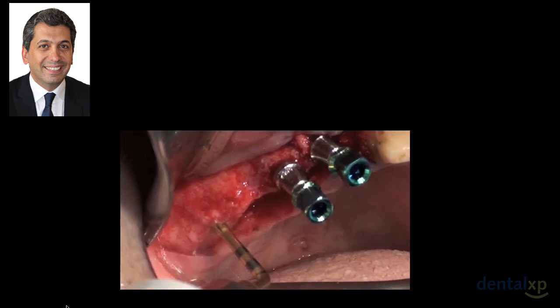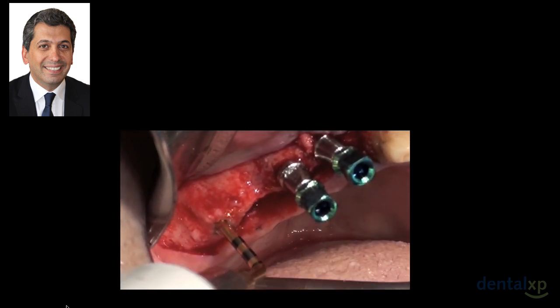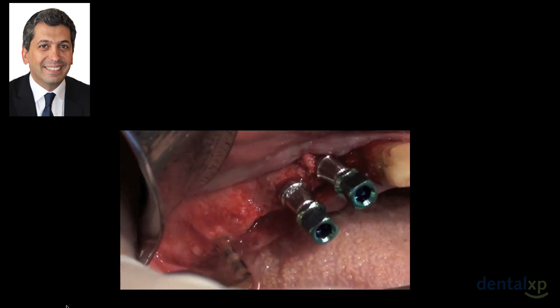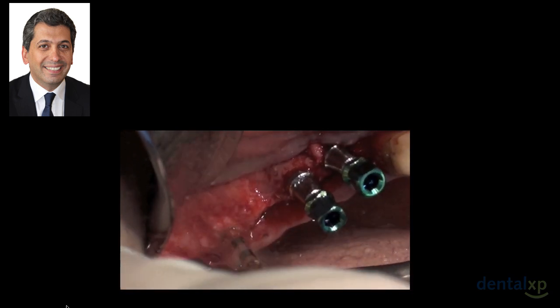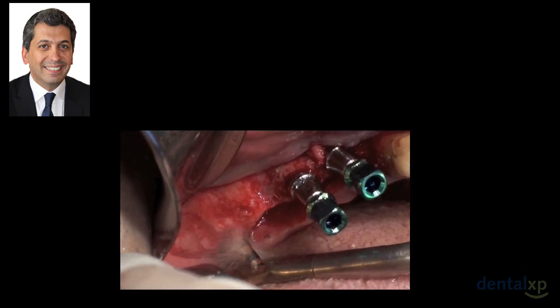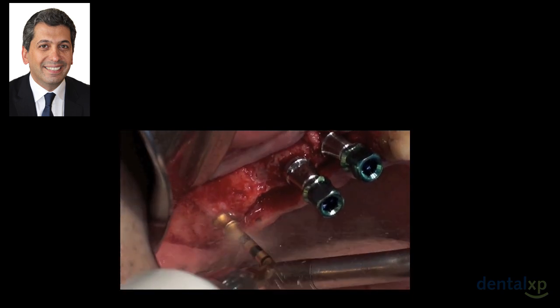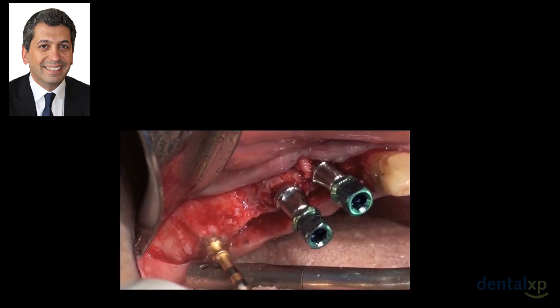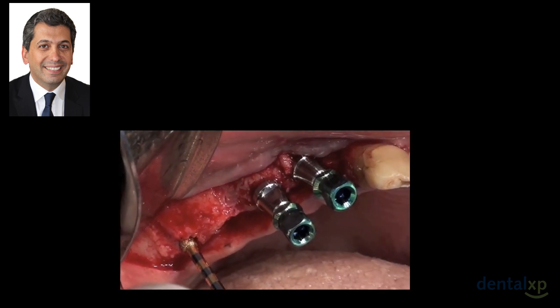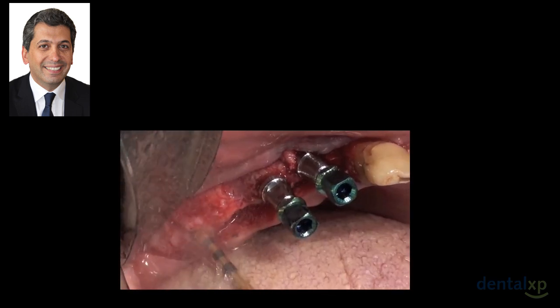One big advantage of the ultrasonic device today is that we can do what we call an ultrasonic implant site preparation. Besides the biological advantages of this technique, I will discuss here one main advantage, which is that when we use the ultrasonic device to prepare the bone under the sinus, we are more precise and we have less chance of perforating the Schneiderian membrane crestally.